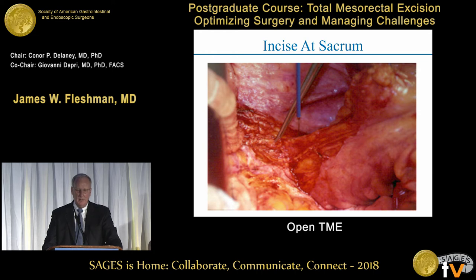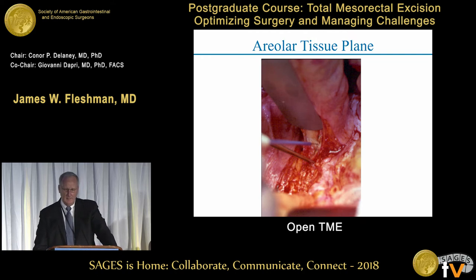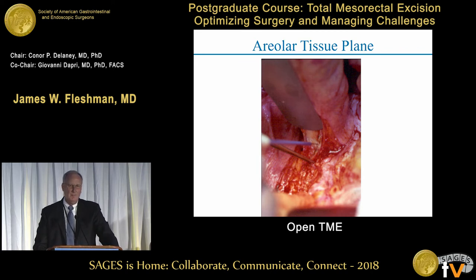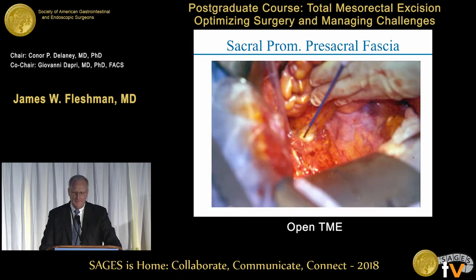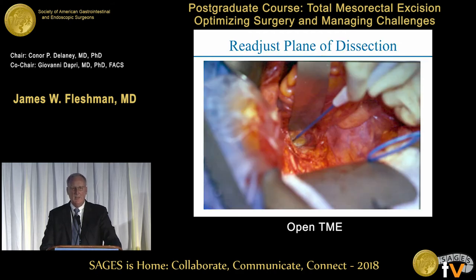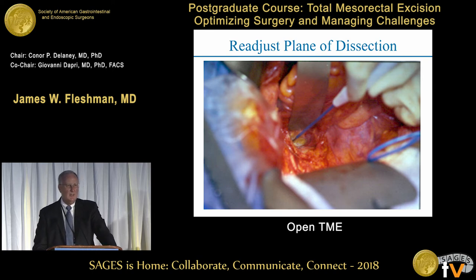We start at the sacrum; we make an incision in the areolar tissue plane — you can see the nerves that we're protecting as we go into the pelvis. That areolar tissue plane melts on a very low cautery setting, and I would suggest switching to a low wattage cutting setting on your cautery. The presacral fascia is your guide: if you can follow that all the way into the pelvis, you've done everything you can to maintain the envelope of the mesorectum. Taking a small thin lighted retractor or a malleable retractor to give upward lift without actually doing the dissection is a secret that helps in a patient who has an upside-down Coke bottle pelvis.